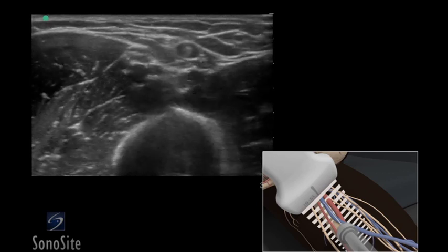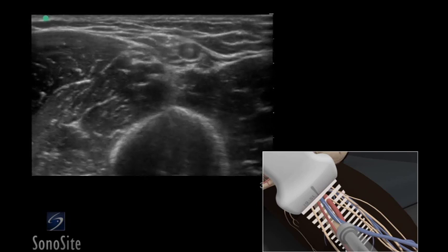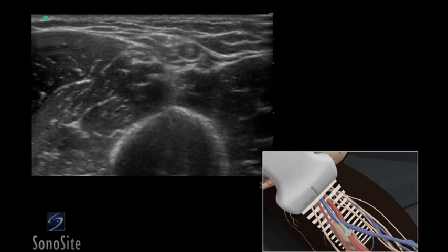The transducer should be moved slightly proximally and distally to confirm that the needle tip lies in the mid-portion of the basilic vein. This technique can also be used with the deep brachial or cephalic vein.